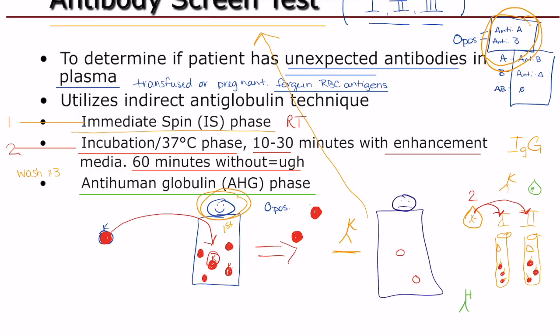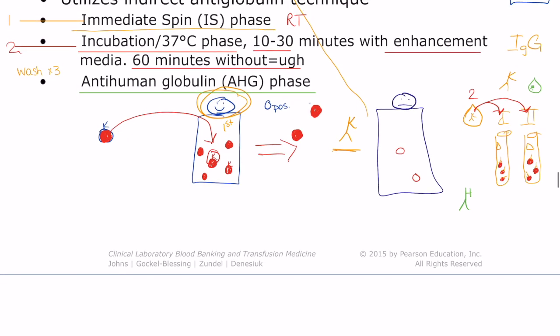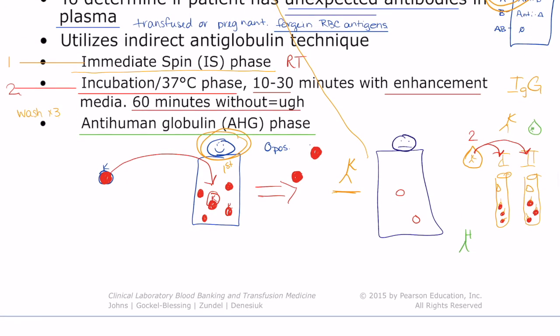So what it does when it's in there, let's draw a bigger picture. We're going to go over this as many times as we need to. So go right here. I'll just draw a slightly larger tube. Here's our red blood cell. We're going to put this anti-Kell on it. Remember, he's kind of wimpy, he can't form that bridge.